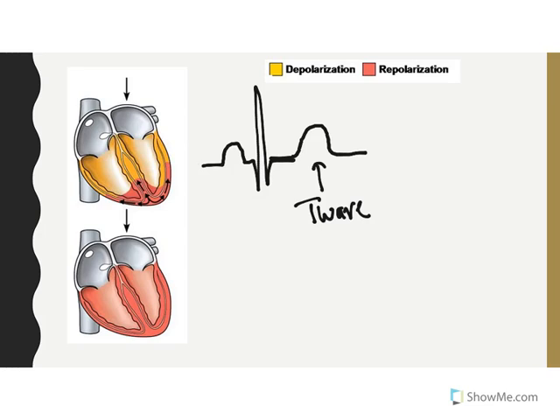Now it is wider than the QRS because repolarization does not utilize the cardiac conduction system. So it takes longer to repolarize the ventricles than it does to depolarize them. So all of it, as it's going up and going down, represents repolarization. Most of the maximum potential difference is being recorded here at the peak. It's just not as much being recorded here, but it's still repolarizing.